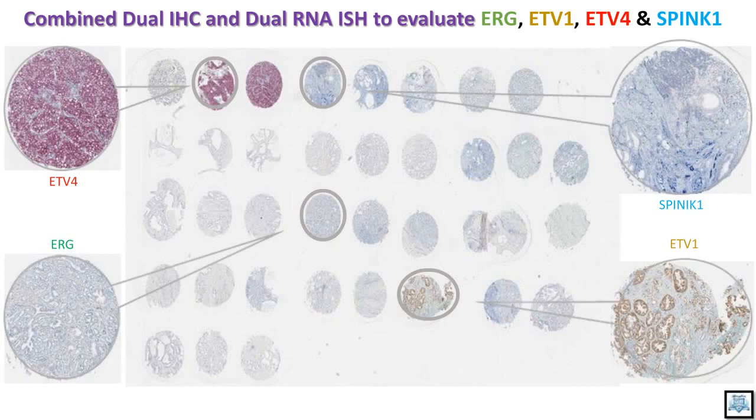I think this approach is very useful, especially when you are limited by the amount of tissue available for hybridization. If you have a biopsy from bone metastasis, a lymph node biopsy, or a needle biopsy with a very small amount of tumor, you don't have the luxury of cutting multiple slides. If you want to screen all 4 markers, you don't want to waste 4 slides; with a single tissue section you can get this kind of valuable information.